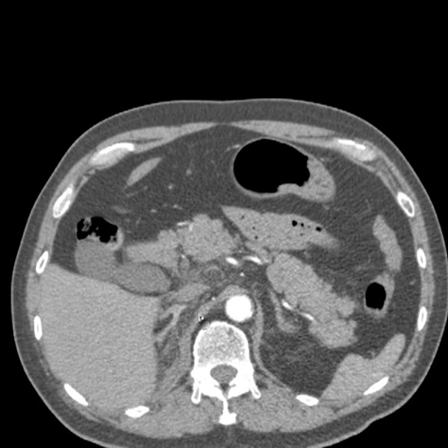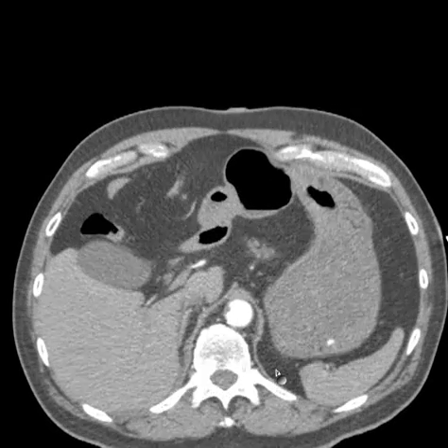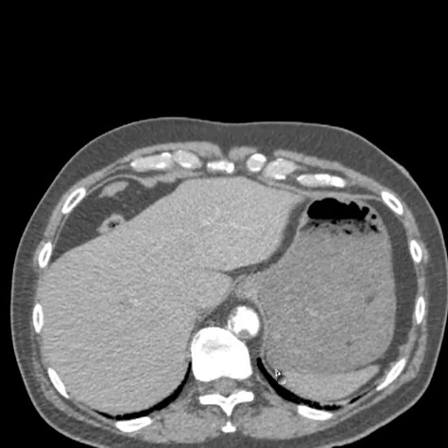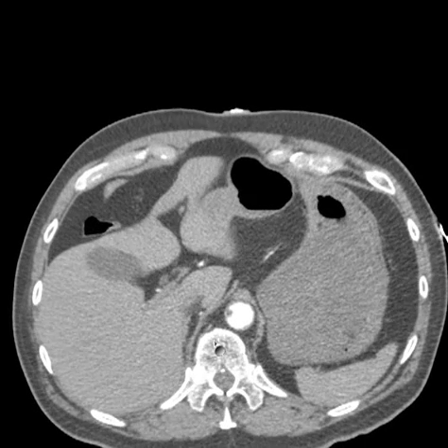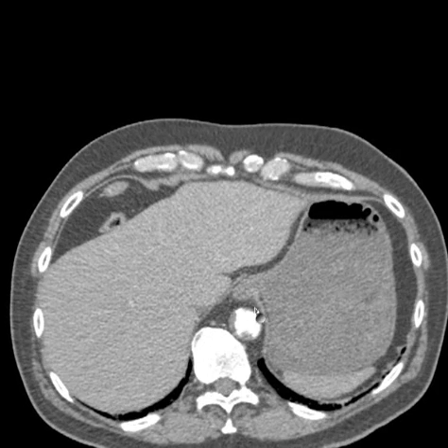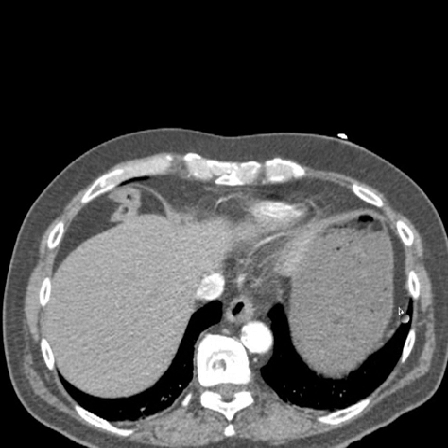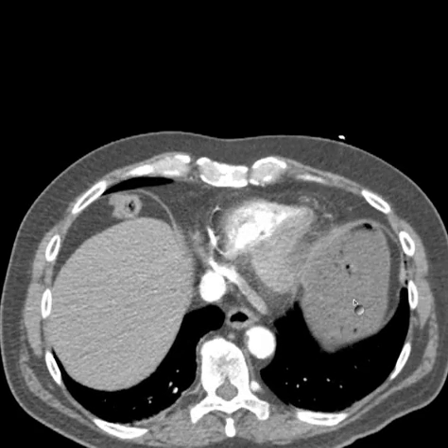Now we're in the upper abdomen. Here you see the aorta. These are the crura — the plural of crus of the diaphragm is crura. The right crus and left crus of the diaphragm represent the crura. Going up higher, each of them here — right and left crura. As you go up, this one here is starting to arch up, and now you can see it is the diaphragm going up over the stomach.